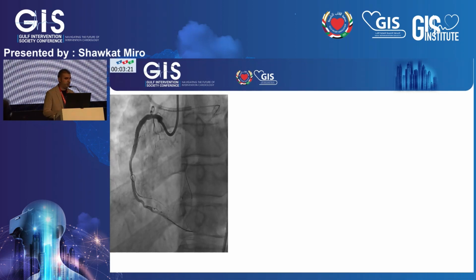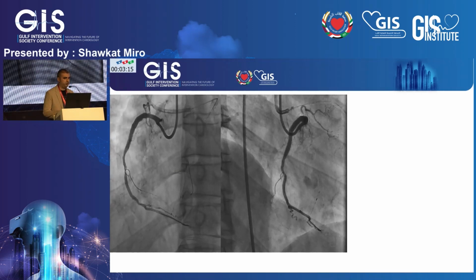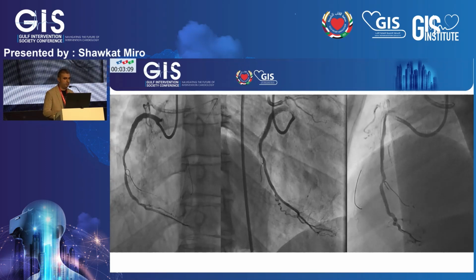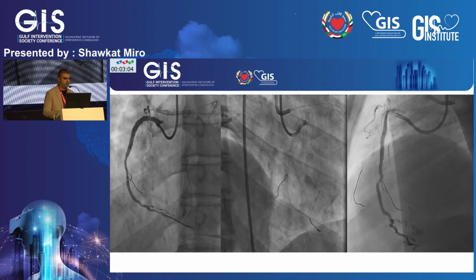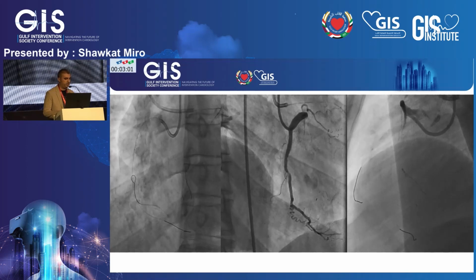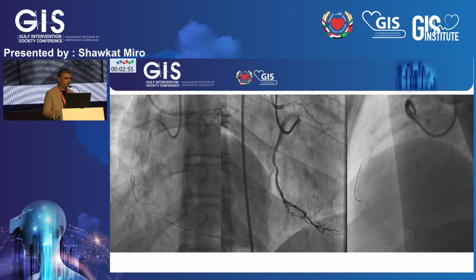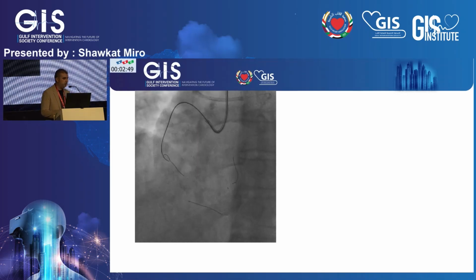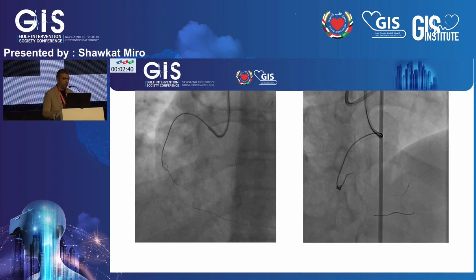I started to give some antegrade injection to confirm the site of the proximal cap in different views, LAO, RAO, and lateral shots. Now the proximal cap is almost clear. Since I was unable to advance my retrograde microcatheter to change to a stiff wire to penetrate it, I kept my wire there, removed that microcatheter and inserted a 1 millimeter balloon as protection over that wire in the septum. I came antegradely with the Gaia Next 3rd with the same Corsair Pro microcatheter, and I did puncture and followed my retrograde wire, and it was moving very nicely.